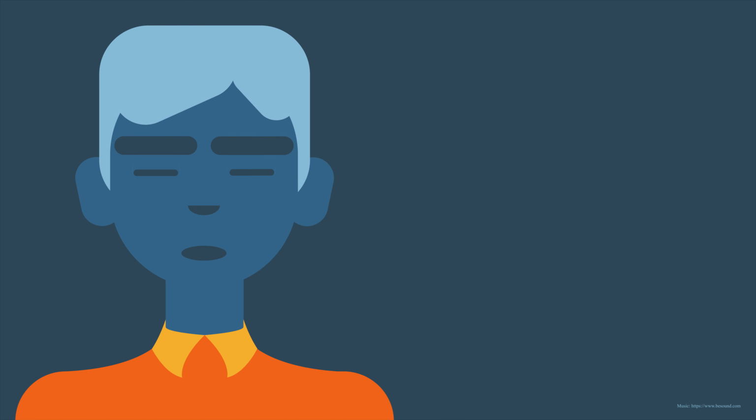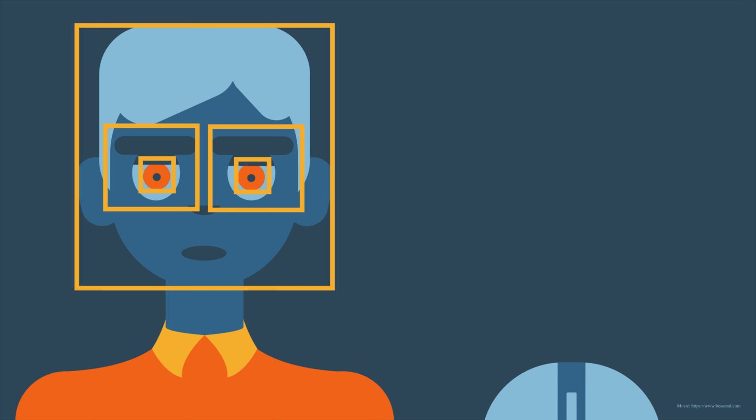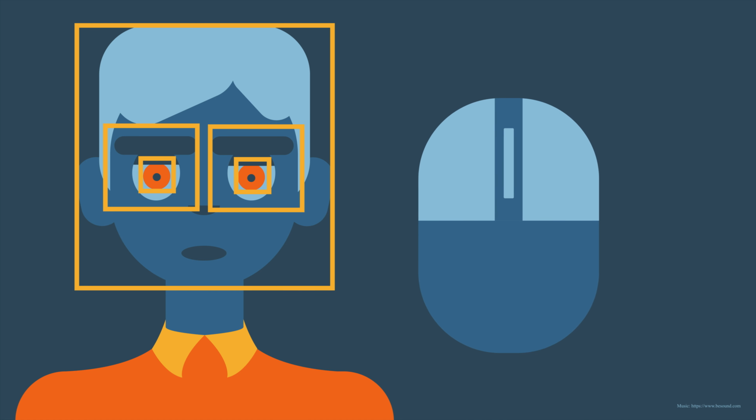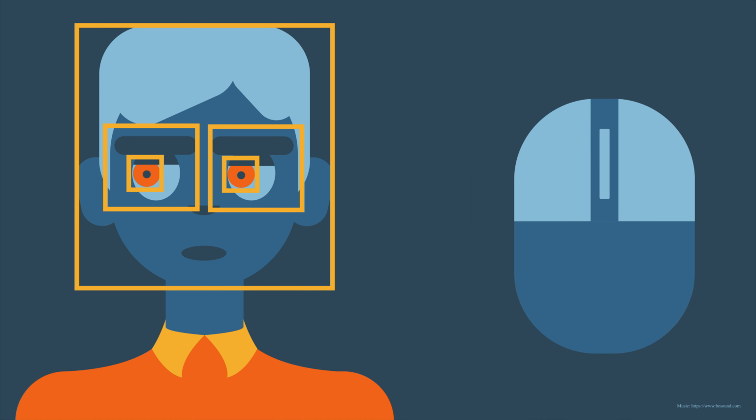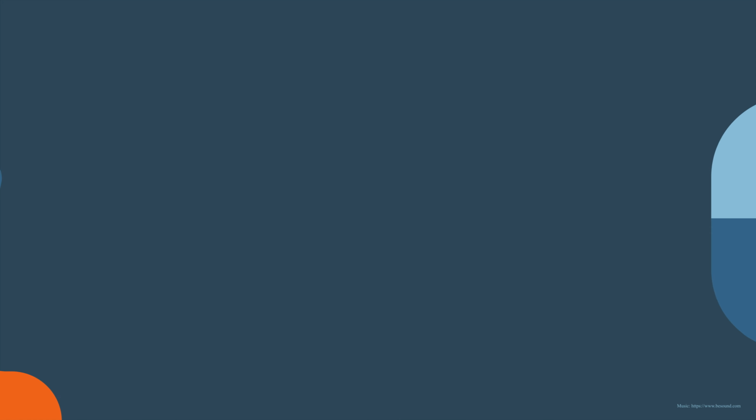How it works: the software tracks and identifies faces and looks for eyes, then tracks pupils and their movement. The eye movements are read by the system, which interprets these movements onto a keyboard, which is widely used by people who have this disease and was a method of communication first used by the acclaimed guitarist Jason Becker.